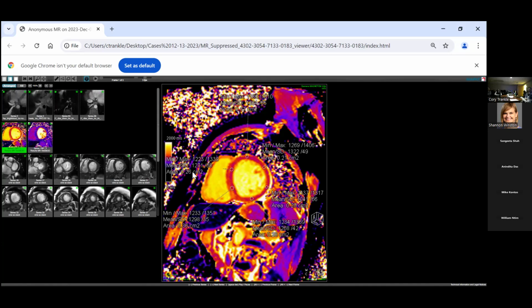And very nicely, you can see what they are with the LV myocardium, look at these ones in the center with the blood pool. What's in blood? Water. Lots of hydrogen nuclei bound to oxygen. Look over here at our scale. Go up here and they're going to be very high numbers. Right. Makes sense. That's the T1.